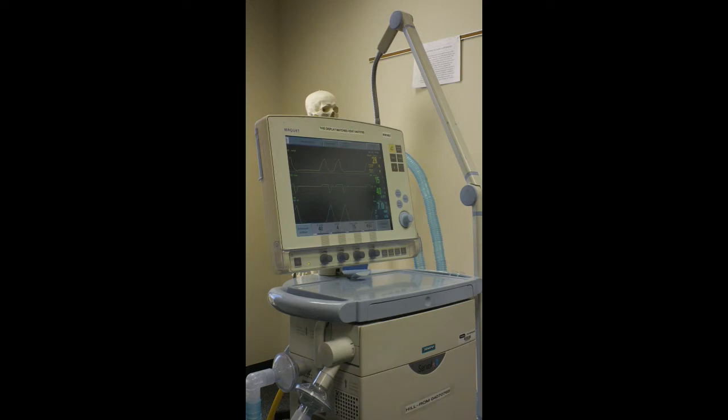What did everybody get a chance to write down? I don't want to go too fast. Increasing plateaus means decreased compliance.